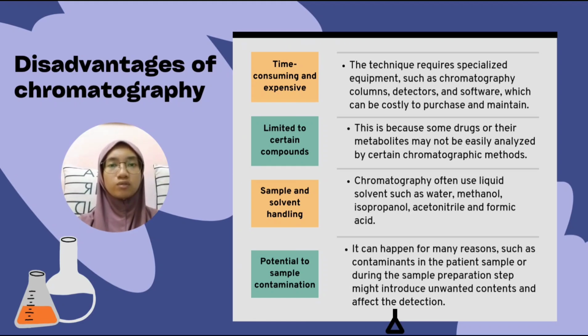Lastly, potential for sample contamination. Chromatography can lead to the potential for sample contamination. It can happen for many reasons, such as contaminants in the patient sample or during the sample preparation step might introduce unwanted contents and affect the detection.